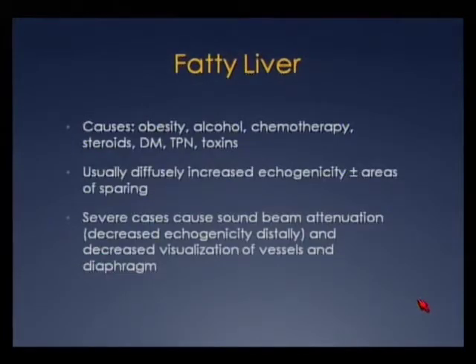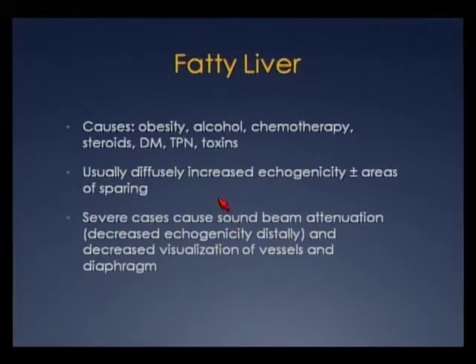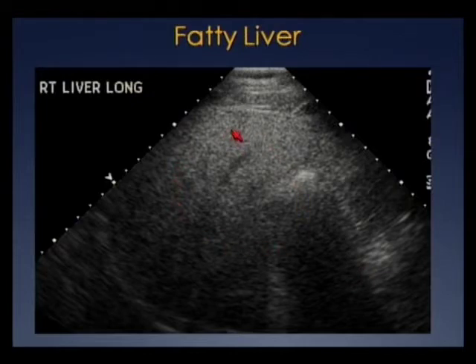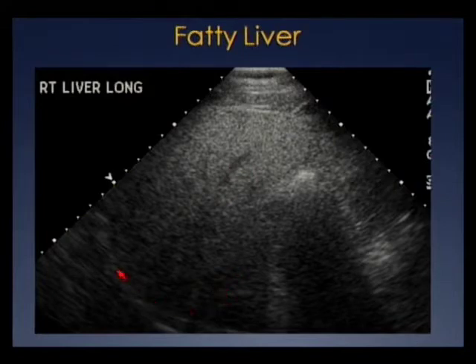Discussing parenchymal liver diseases, starting with fatty liver: the most common causes are obesity and excessive alcohol. We usually see diffusely increased echogenicity of the liver plus or minus areas of sparing, and in severe cases we'll see sound beam attenuation and decreased visualization of vessels and the diaphragm posteriorly. Here's a case of severe fatty liver where we have an echogenic liver but as we progress more posteriorly, we lose the sound beam — it basically attenuates.